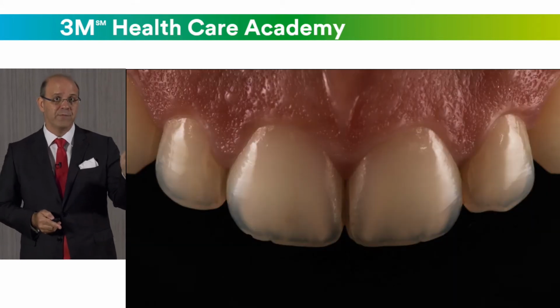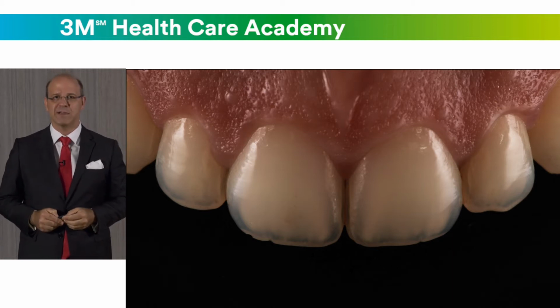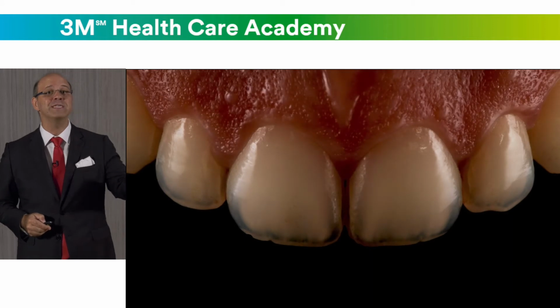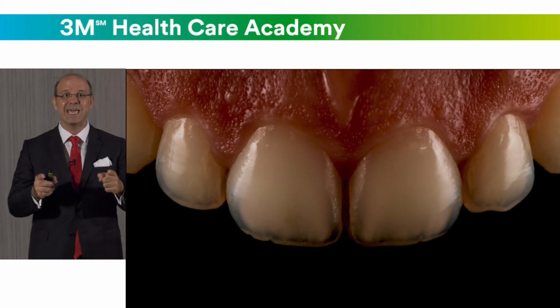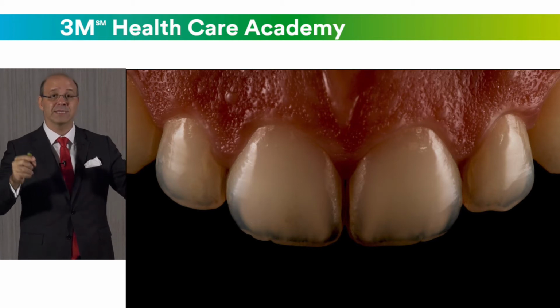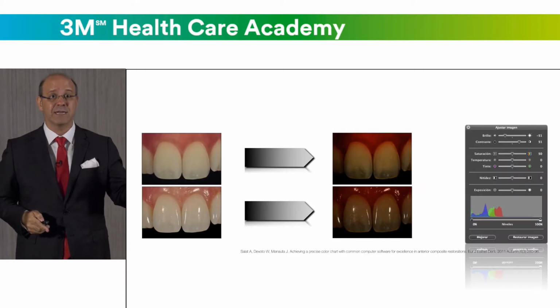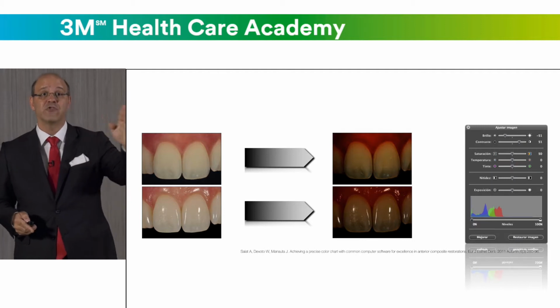One of the tips to see more inside of the tooth is to use dental photography. If you take a photo of your patient's natural tooth, and increase the contrast and decrease the brightness of this picture, we see more difference between the opaque areas, dentin, and the more translucent areas, enamel. There are also articles that already describe this procedure. Always increase the contrast, decrease the brightness.